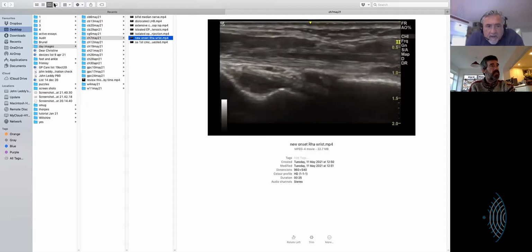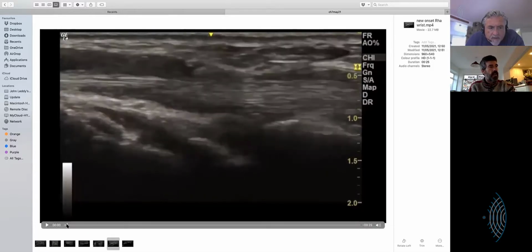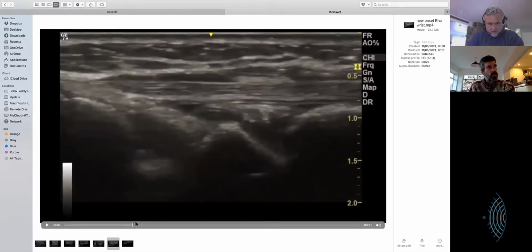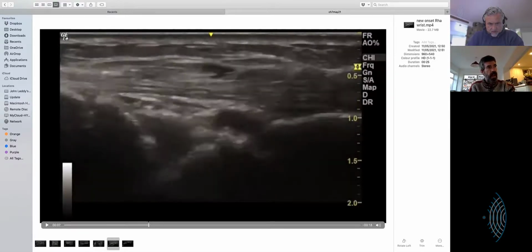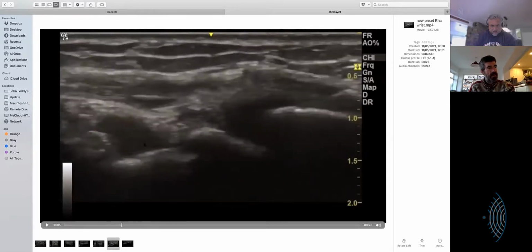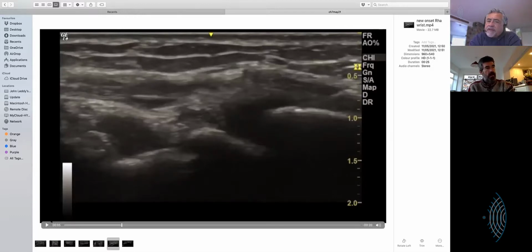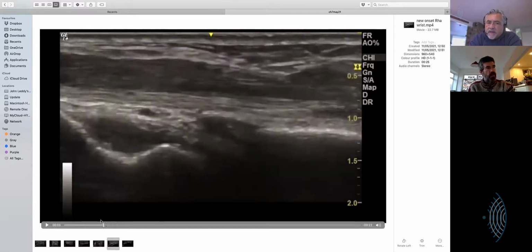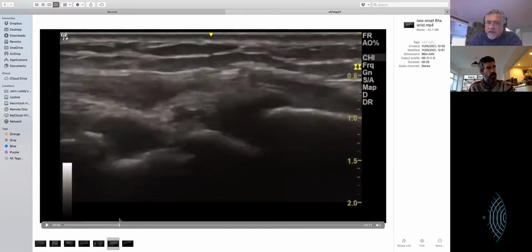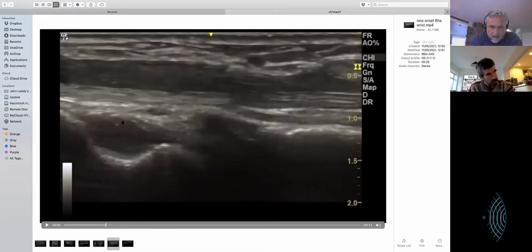Yeah, so this is rheumatoid, and this is unusual in that this patient was booked for a scan and then saw the rheumatology department, and they made the diagnosis. So this was confirmed rheumatoid synovitis here. Because your eyes are looking at the pock marks or the faults in the periosteum below. No, the periosteum is fine. If it looks wrong, it's my bad scanning. What I'm looking for is the curvature on that synovitis.